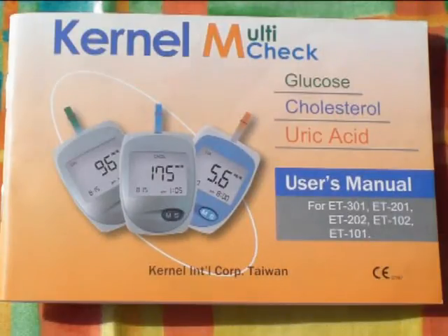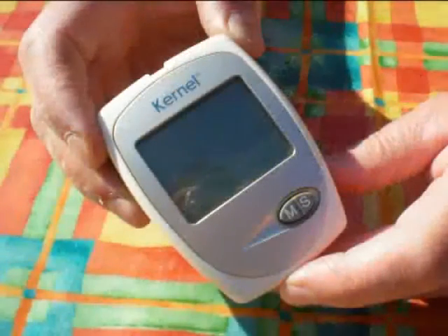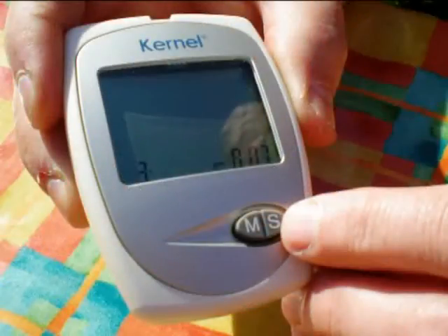Once you have done this, the first thing you need to do is insert the batteries. The meter will turn on automatically and you should then set the date and time. Starting with the month, press the S button until you have the right date. Then press the M button to move on to the year. Repeat this step through the hour and minutes. Once you have done this, do not press the M button again. Instead, wait 30 seconds for the meter to turn off automatically.